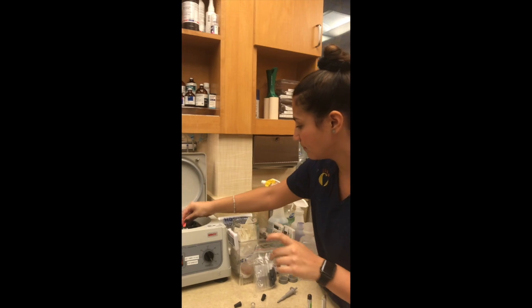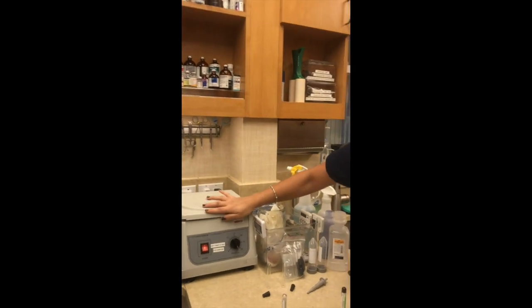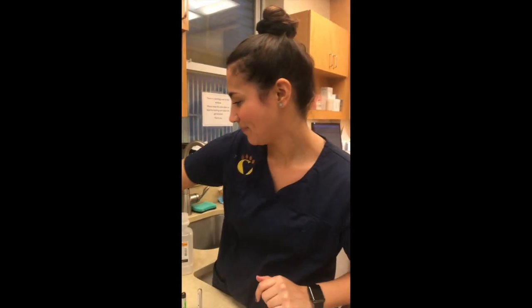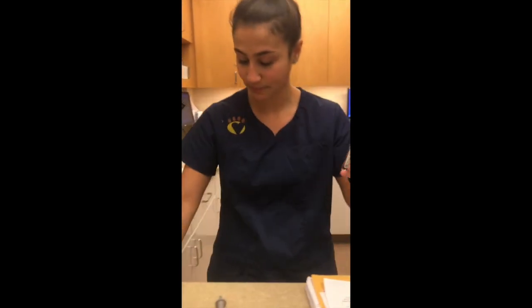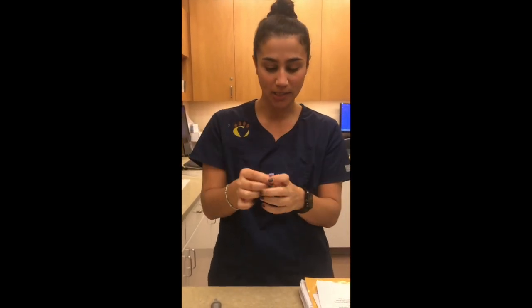From each end. And that's going to go for 5 minutes. So now I have our centrifuged EDTA tubes. So first I'm going to do our donor tube. So I'm just going to decant the plasma.